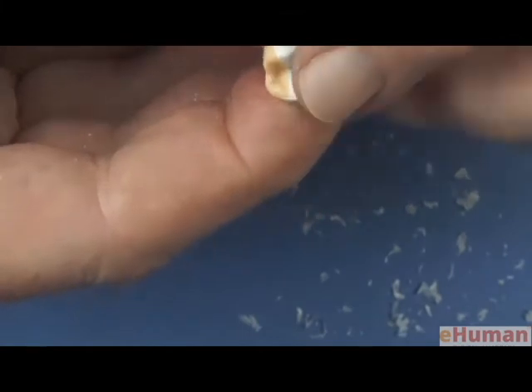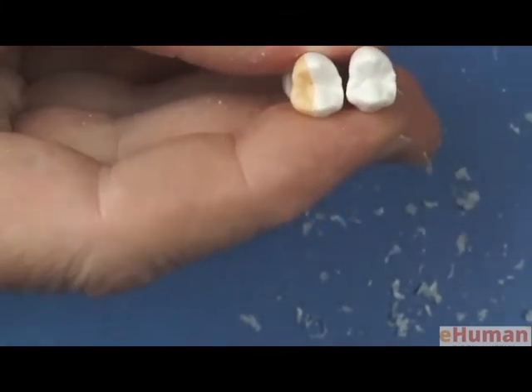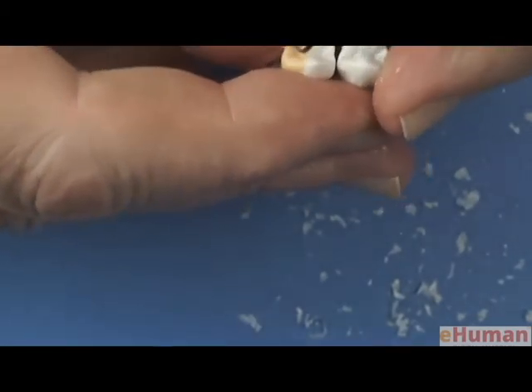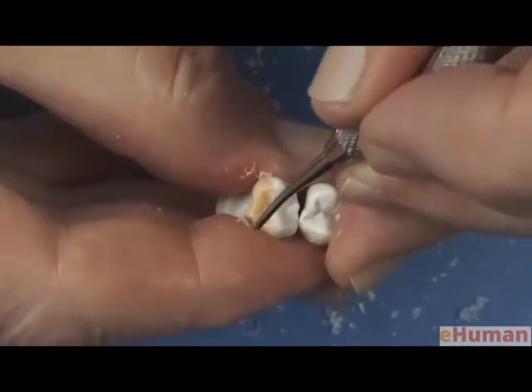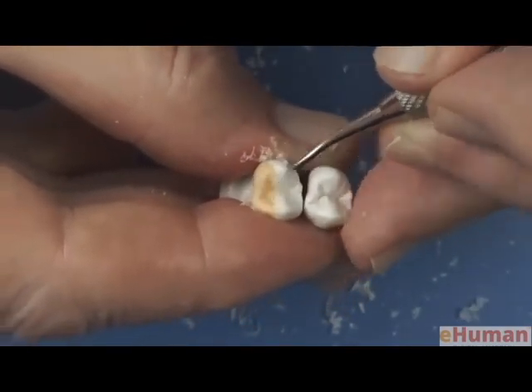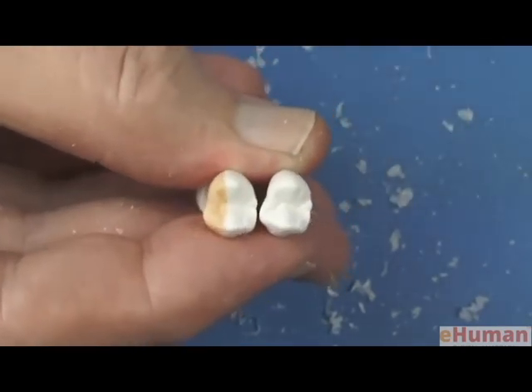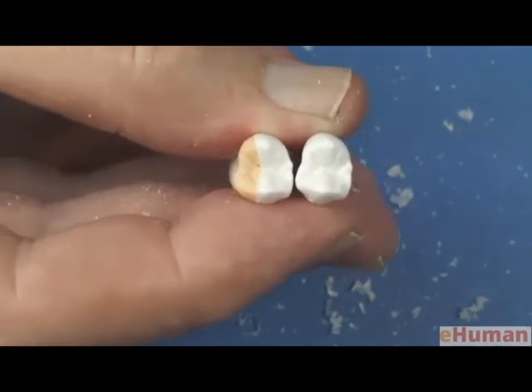And now we want to compare our waxed tooth with the intact tooth to see where we are, and we're getting pretty close to what we're looking for. A little rounding and smoothing here, and we will be in pretty good shape. And I see down in the surface here, do you notice?